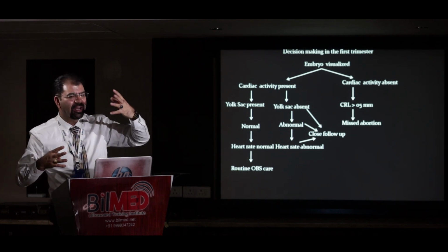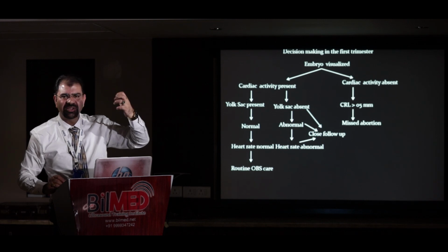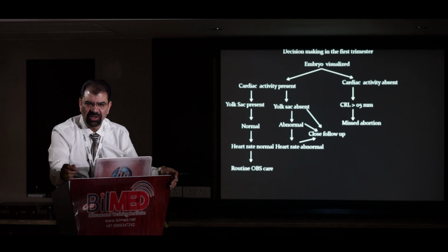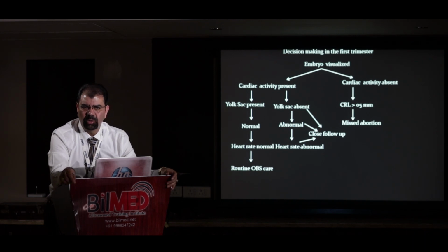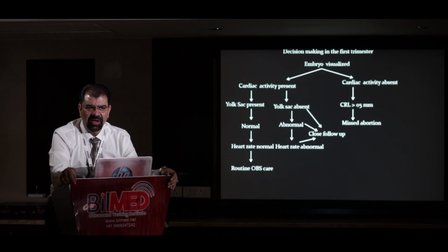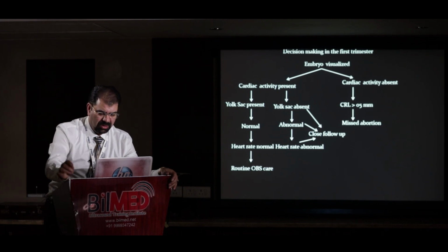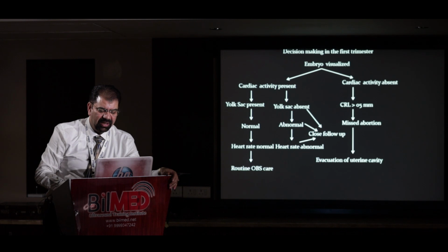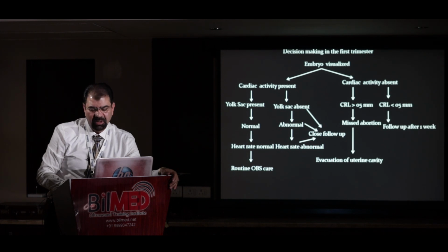And with your naked eyes, you can see on the screen if the scan plane is going through the heart, and color is just to demonstrate on the patient, and we will not recommend you to put the color in very early pregnancy. So anyhow, the way is this, and if it is less than 5, you can follow up. Why?